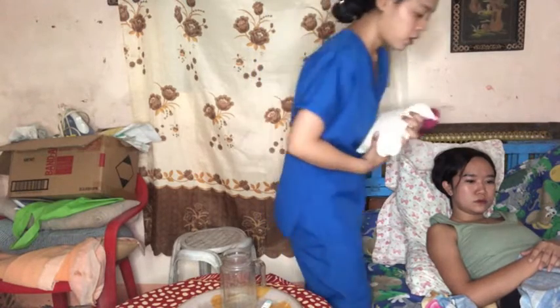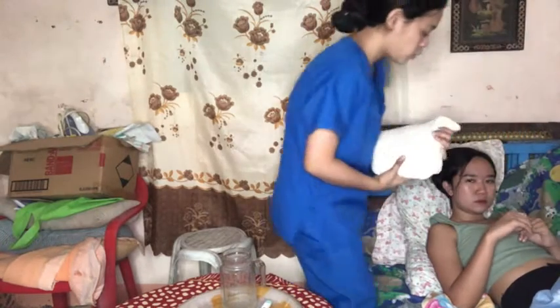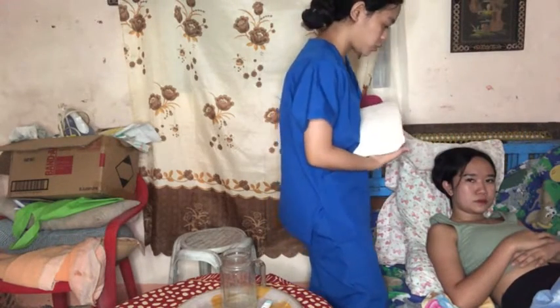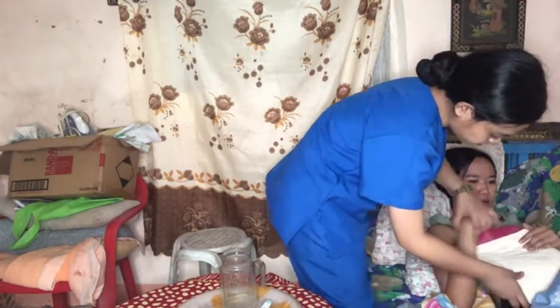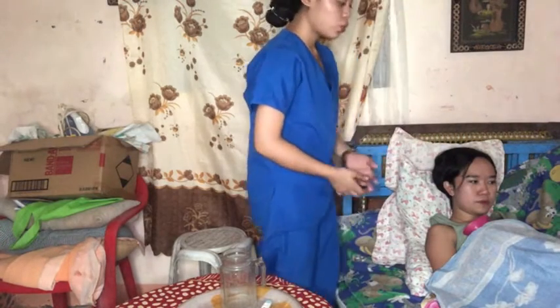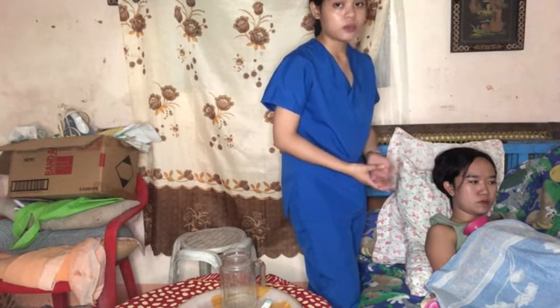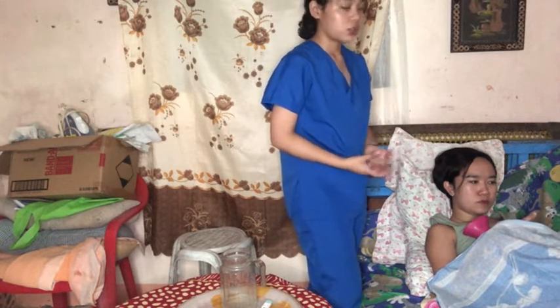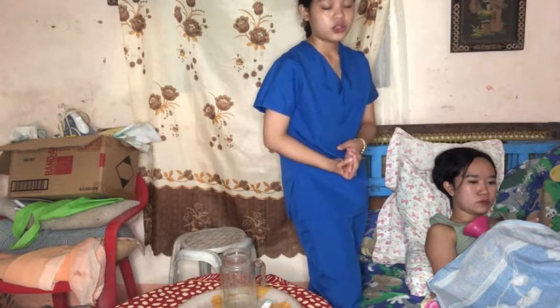So, first, unfold the drape of the patient and expose the area. So, ma'am, I'm going to place the hot water bag to your affected side. Ma'am, can you hold this for me? Then next, we need to apply this hot water bag for about 15 to 30 minutes before removal, and it also depends on the doctor's order.